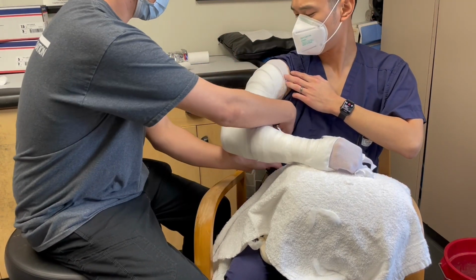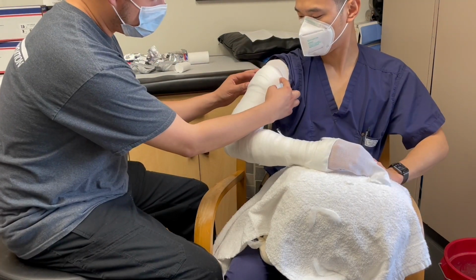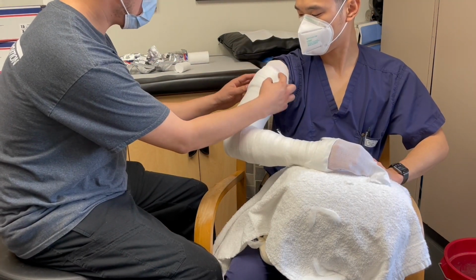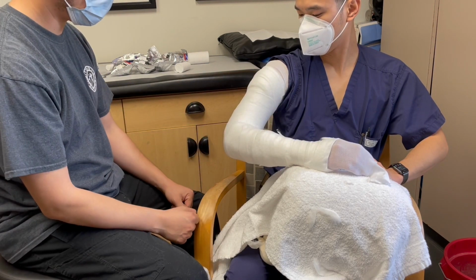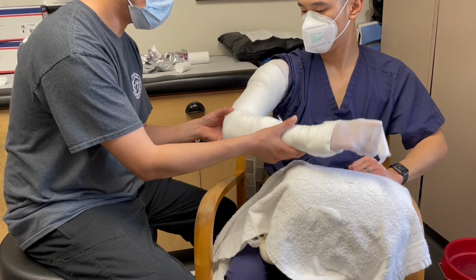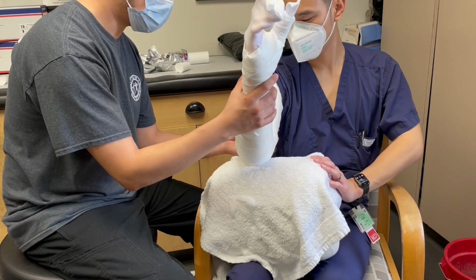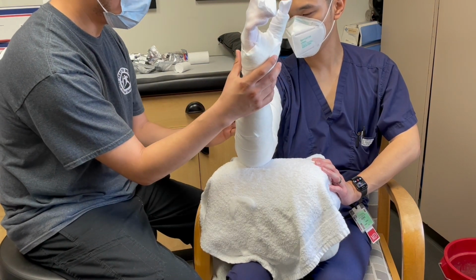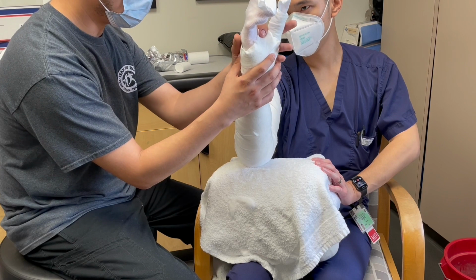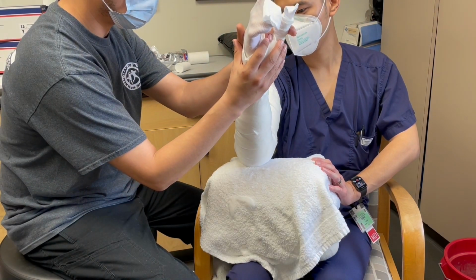Here we add the proximal padding. This completes the padding for a long arm cast. We can now reposition the arm and make sure that the patient is still in the desired position. Watch for radial and ulnar deviation.